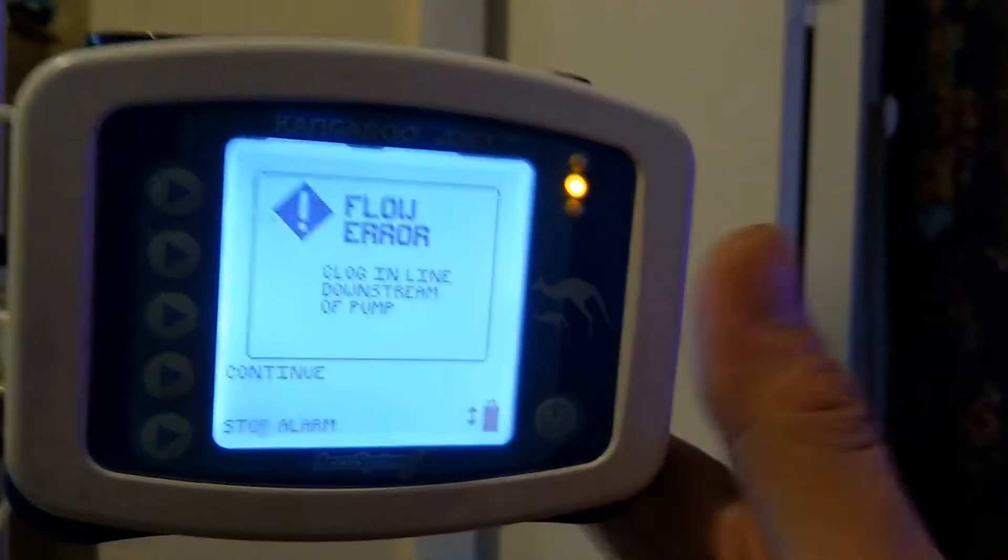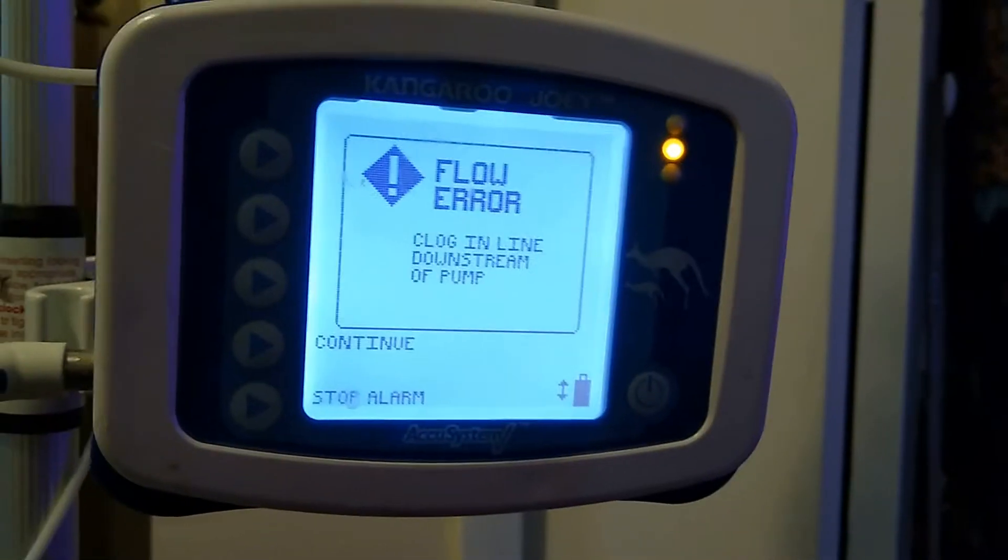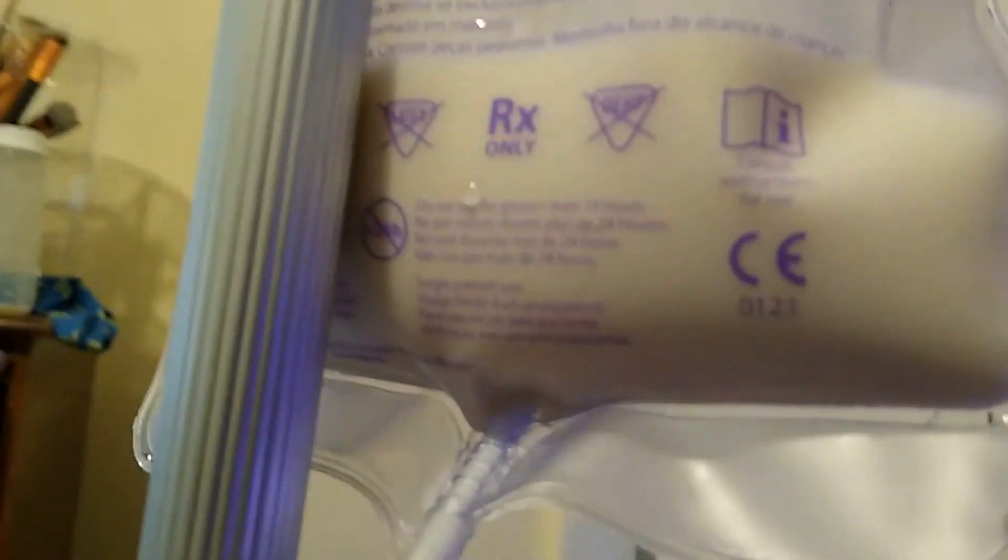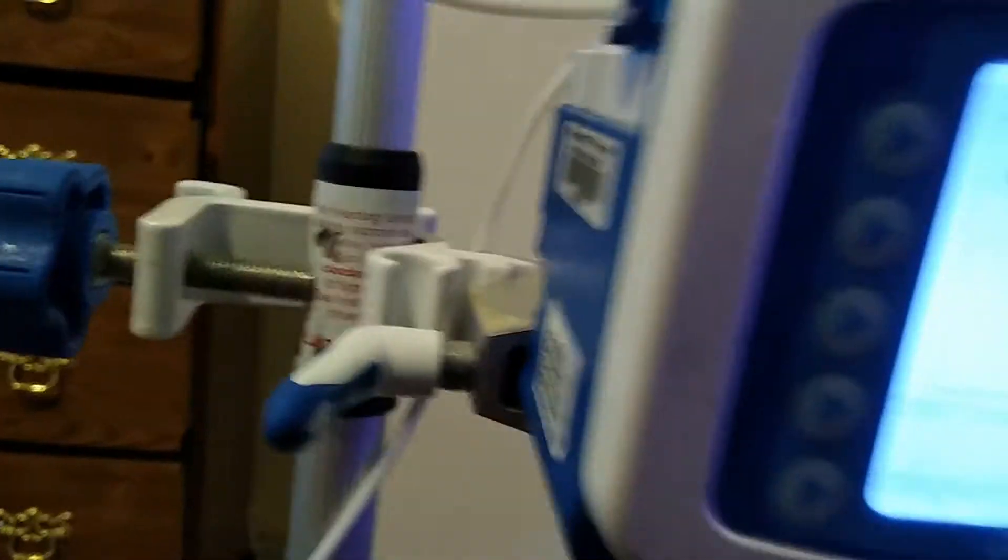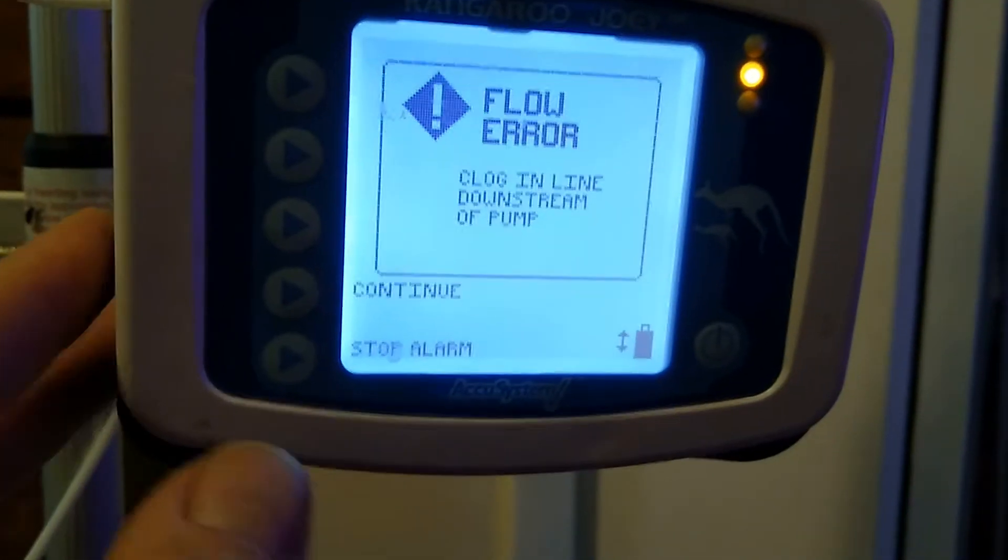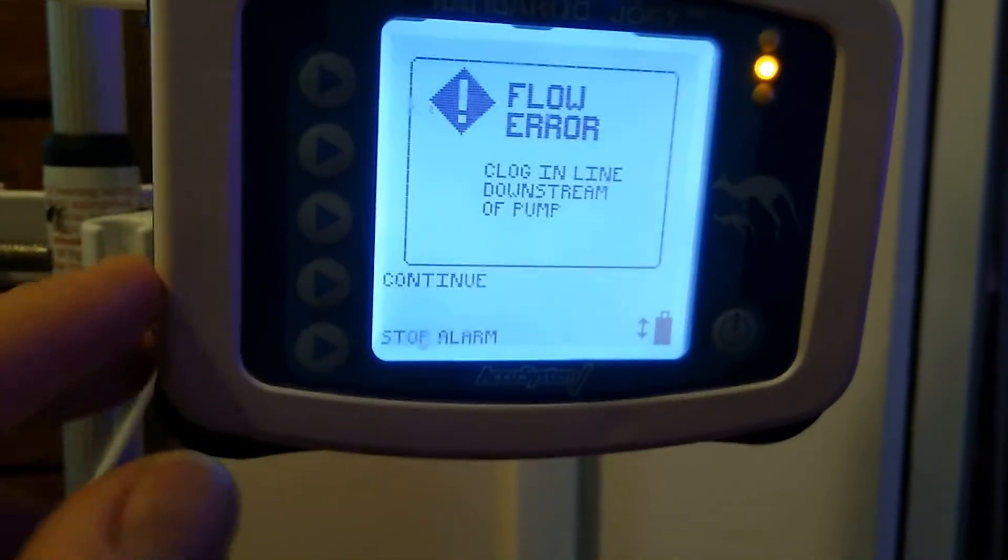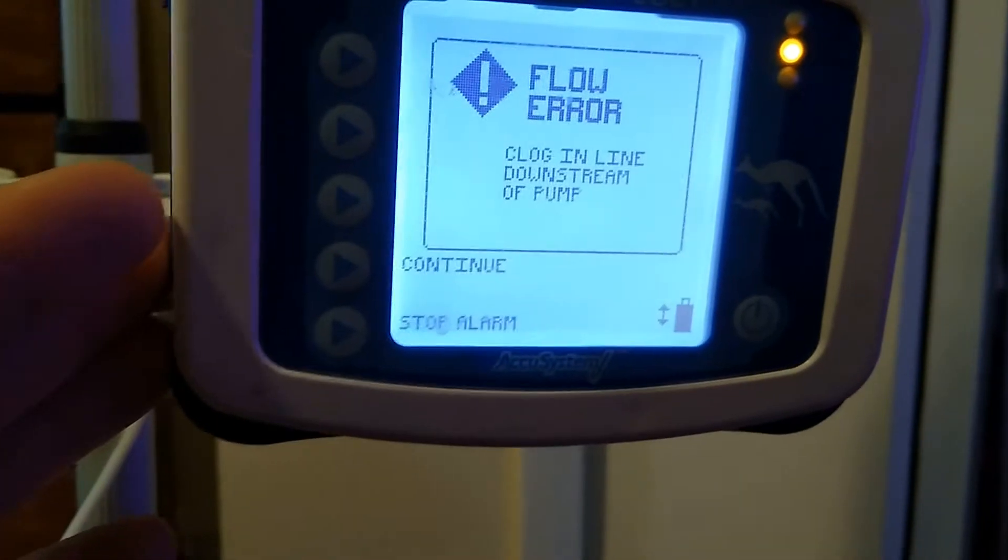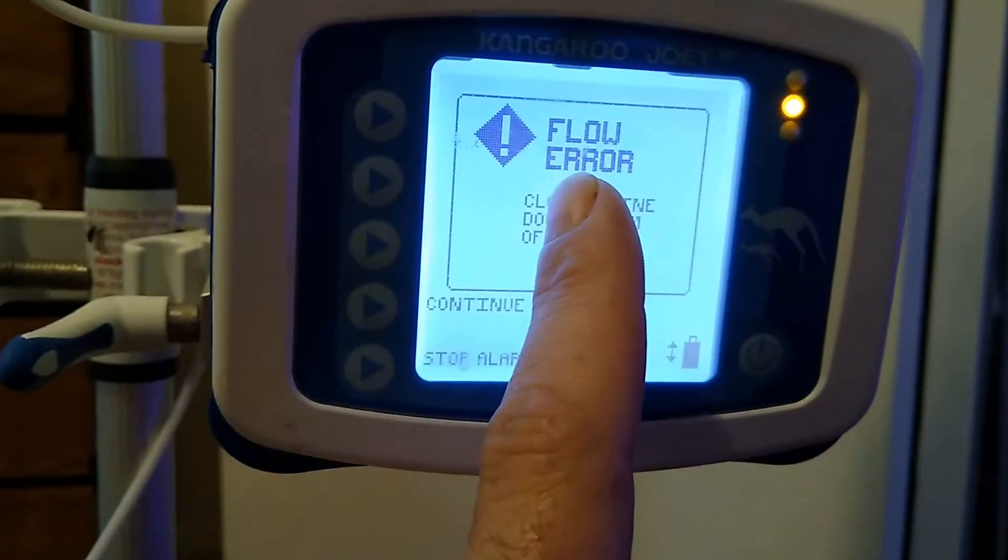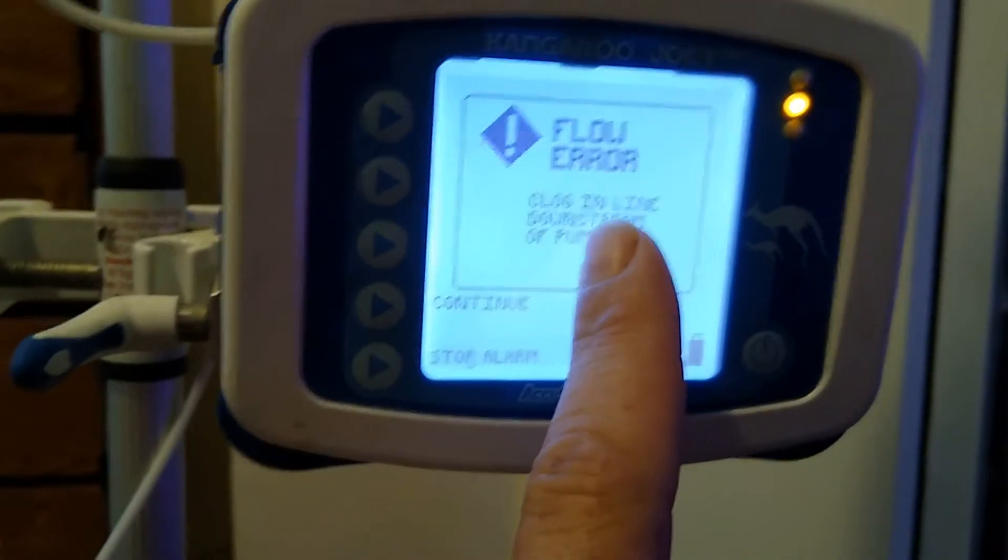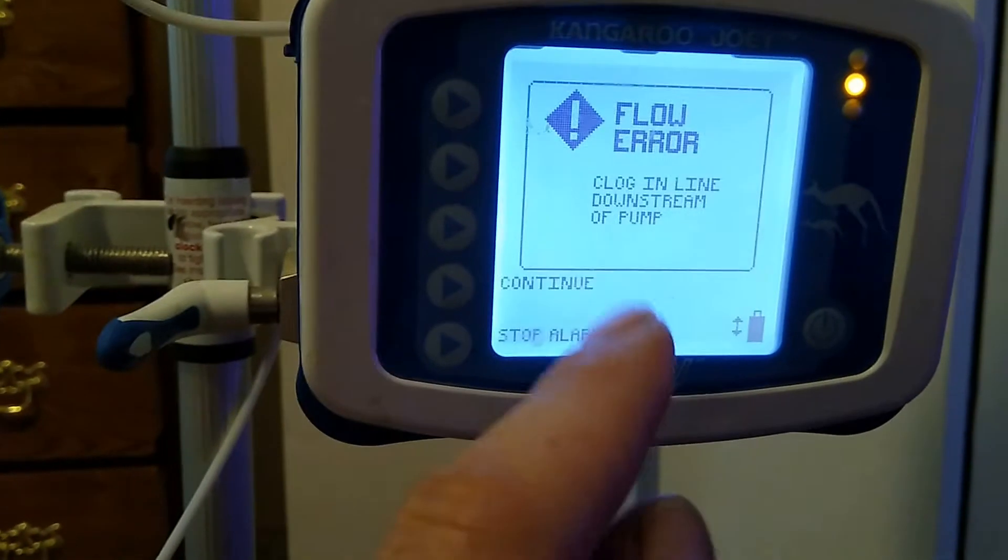These machines are very temperamental with a certain issue. As you can see, this is a brand new bag. There is no clog in the line. You can hit continue and it'll run for maybe another minute, and then you'll get this error again. And this will just keep happening. So it's a real easy fix and I'm going to show you how to fix it right now.